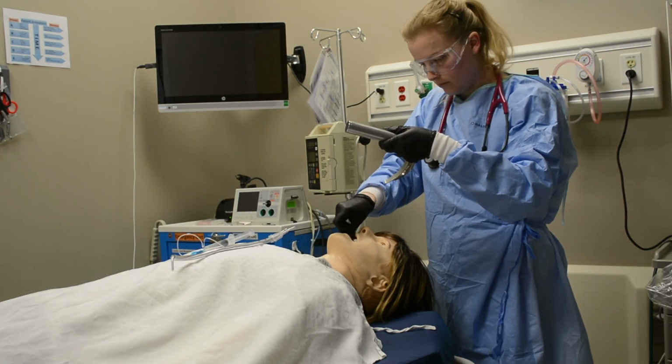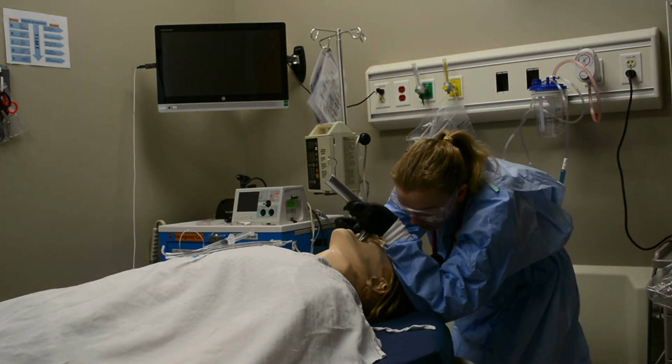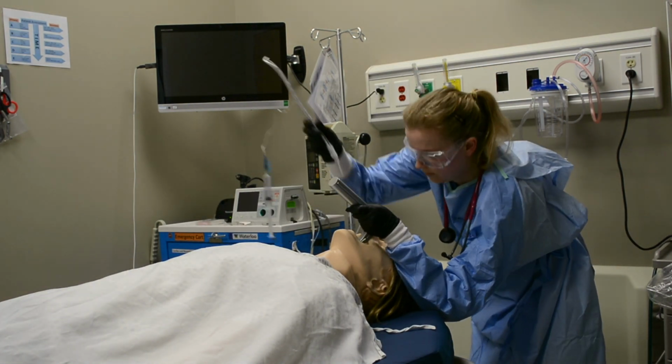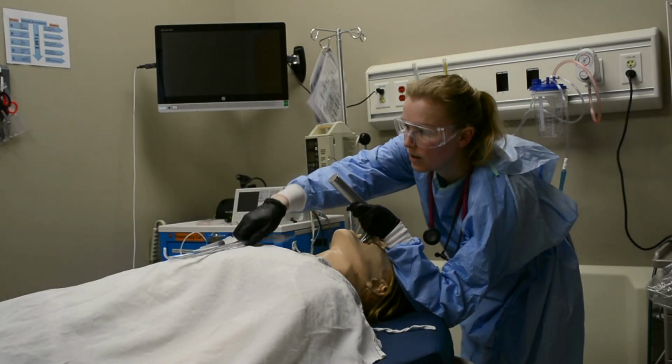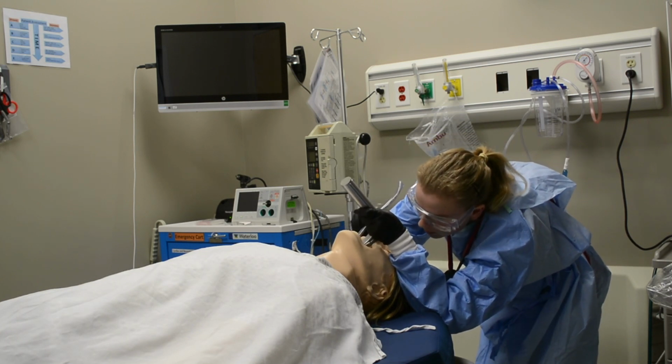Open mouth with thumb and middle finger using scissor technique and carefully insert the laryngoscope. Lift the scope, being careful not to chip teeth. Visualize the vocal cords and advance the endotracheal tube through the cords with stylet inside of the tube.